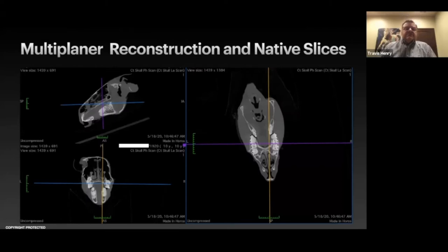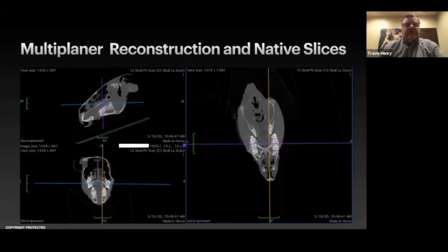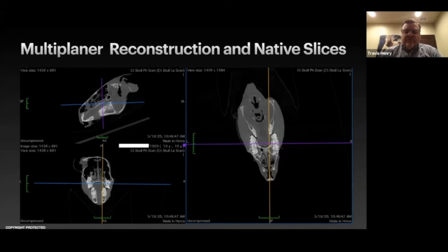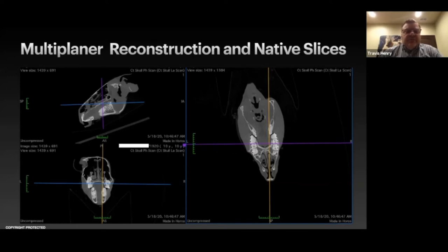Looking at this actual case, you can see the horse wasn't exactly straight in the CT. There are changes in where we can see the eye, and the teeth show the clinical crown inconsistently. In the dorsal view, the horse is clearly not straight. The purple line represents the transverse view, the blue line is the dorsal slice, and the yellow line is the sagittal slice.